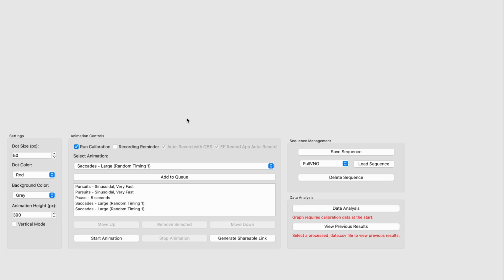This time I'm going to be explaining some ways to do remote testing so that your test subject doesn't have to physically be in the clinic or in the testing area with you. There are a couple of options, so I'll be talking through them.